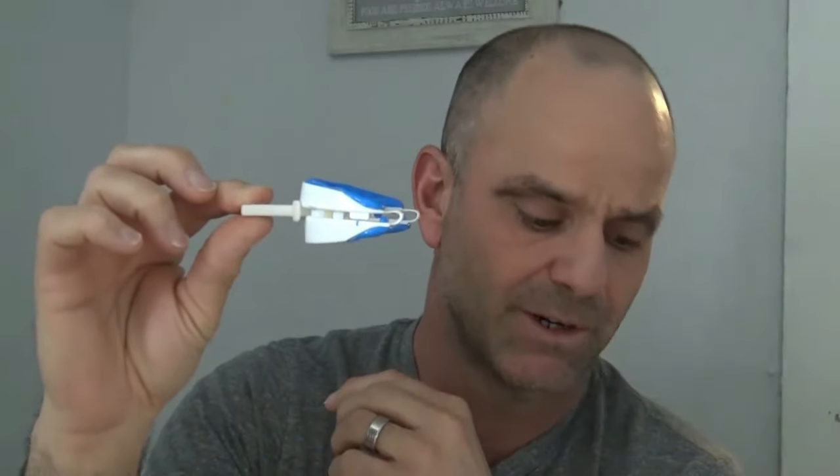Z-Quiet's definitely my favorite mouthpiece — I have not found one that beat it yet. On a side note, I use a CPAP machine now, but I do still use my Z-Quiet a little bit. It also comes with a fitting tray; you just dip it in boiling water and then bite down for a set amount of time.